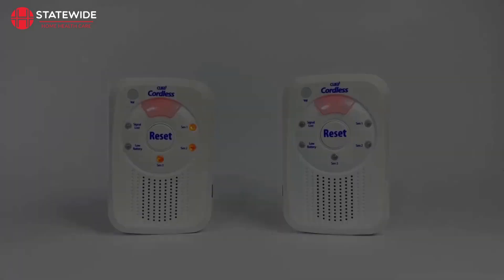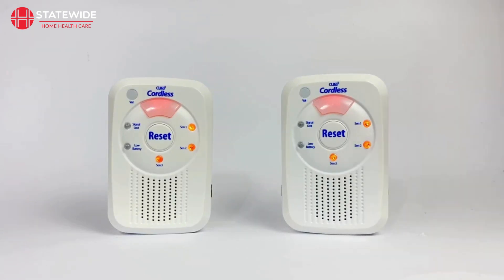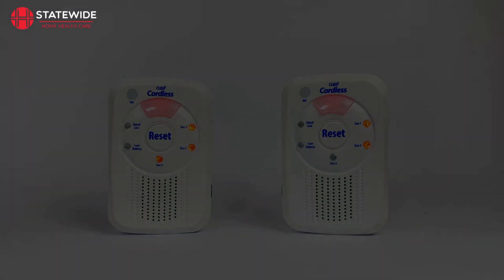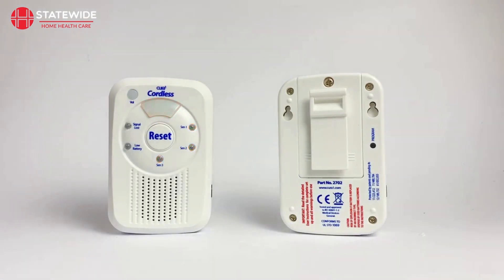To clear an individual channel, push the volume button instead of the reset button whilst in programming mode to select the channel you want. The LED you currently have selected will flash to indicate which channel you are going to clear. When ready, press and hold the volume button until the monitor beeps and the LED turns off. The last step from here is to exit programming mode by pressing the program button on the back of the monitor. The monitor will beep three times to confirm this.